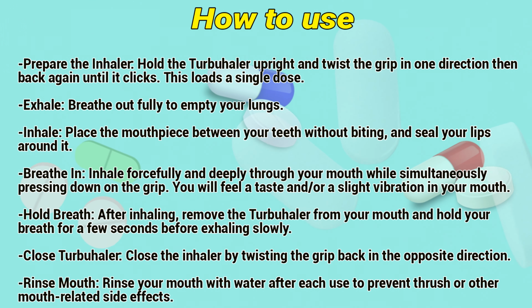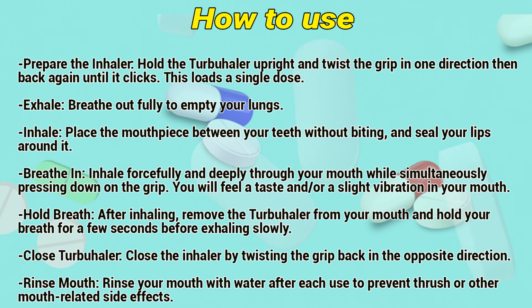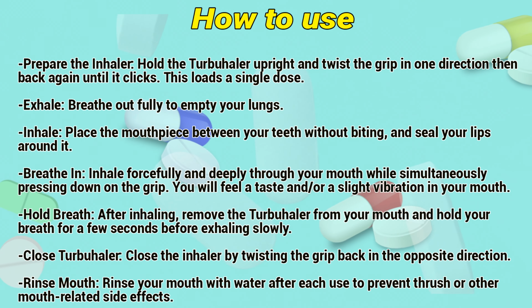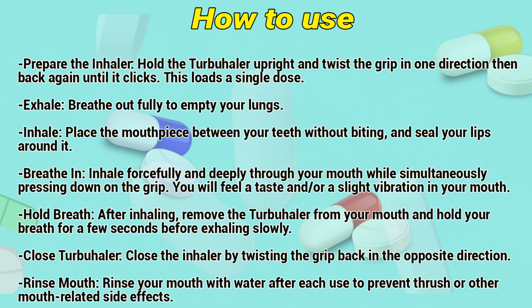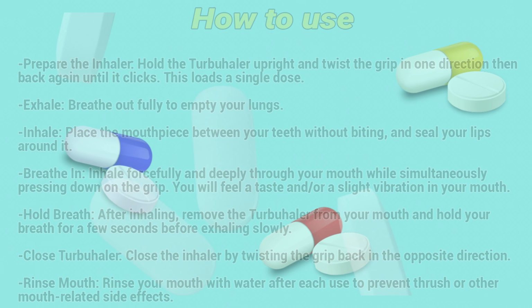Hold breath. After inhaling, remove the Turbuhaler from your mouth and hold your breath for a few seconds before exhaling slowly. Close Turbuhaler. Close the inhaler by twisting the grip back in the opposite direction. Rinse mouth. Rinse your mouth with water after use to prevent thrush or other mouth-related side effects.